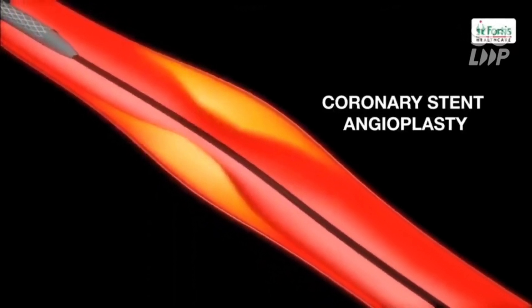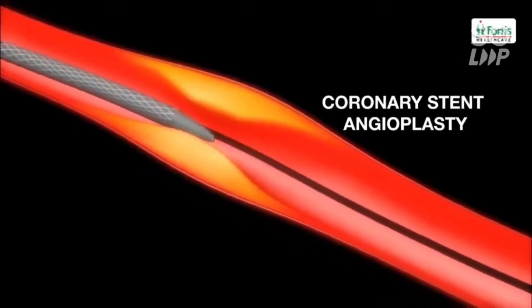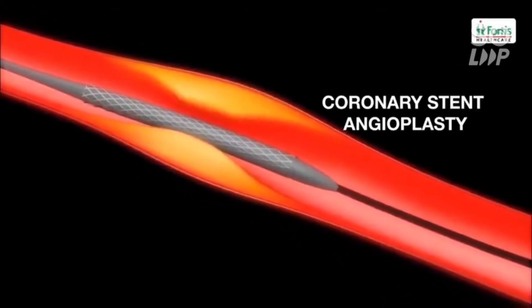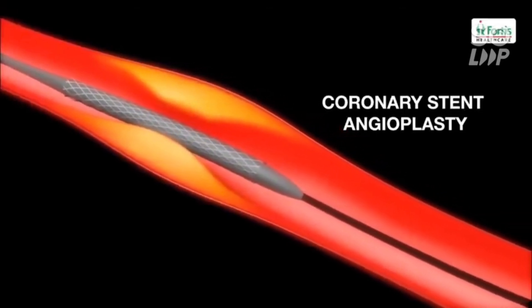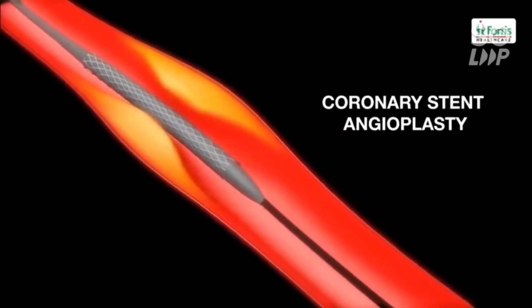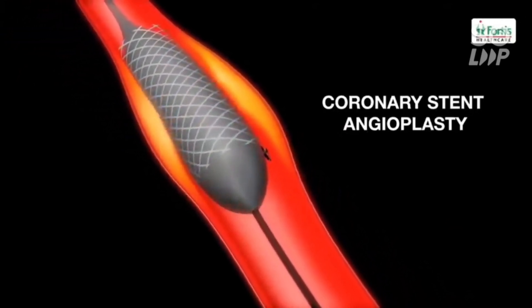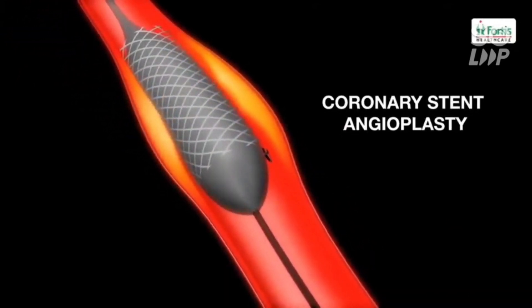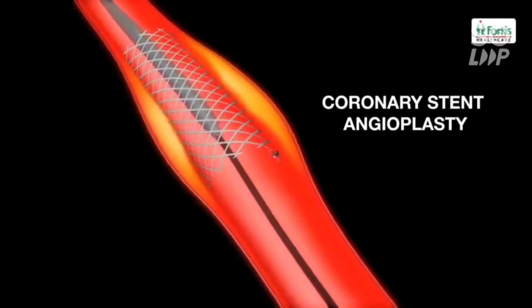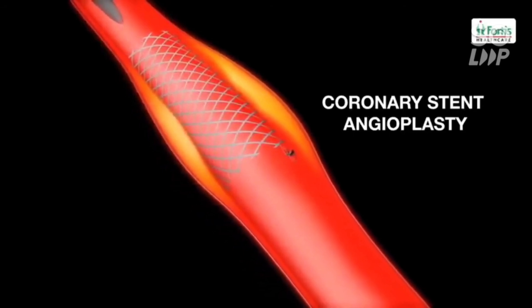A coronary stent is a small tube made of wire mesh designed to keep the artery open once it has been treated. A collapsed stent is placed over the deflated balloon catheter as it is inserted into position. When the balloon is inflated, the stent expands and locks itself into place. The deflated balloon and catheter are then withdrawn, leaving the stent behind to hold the artery open permanently.